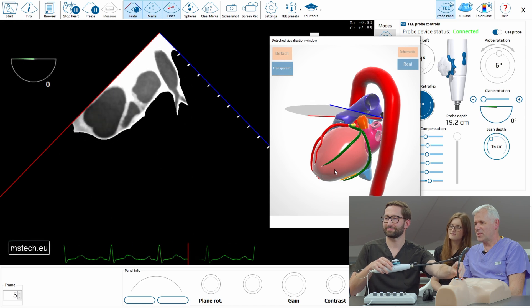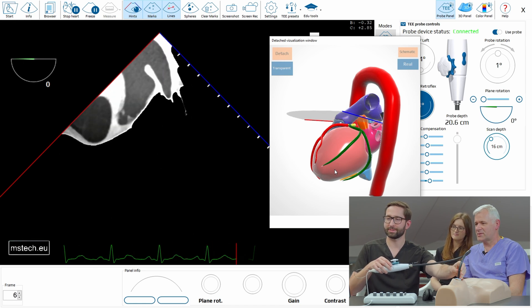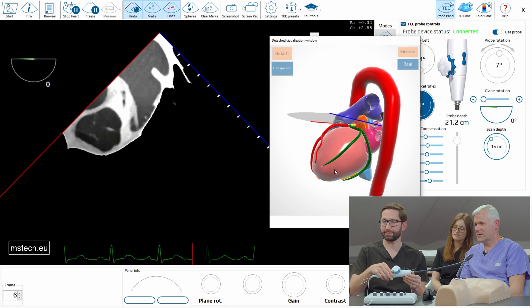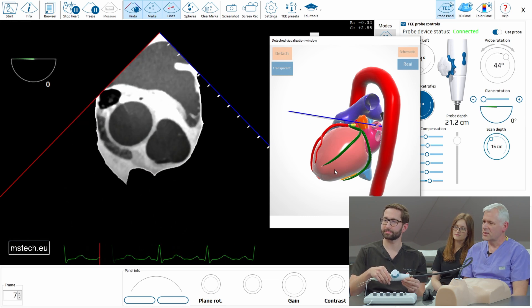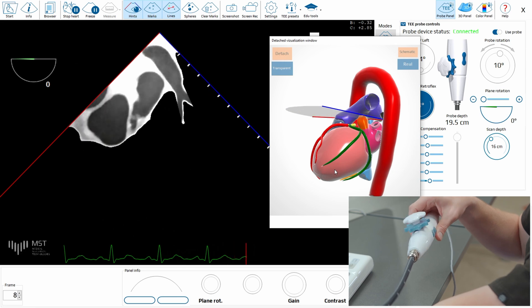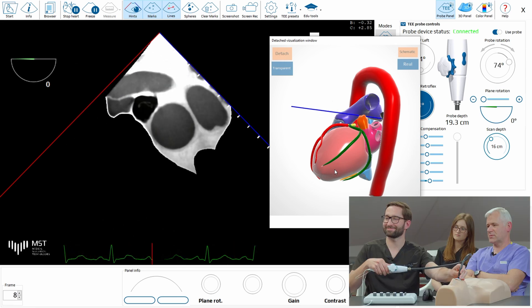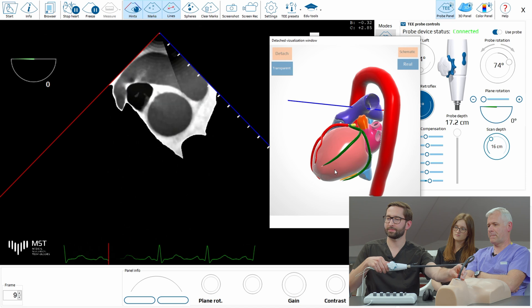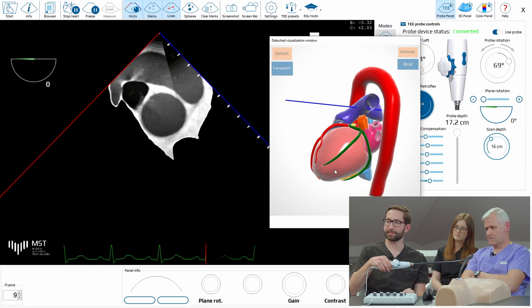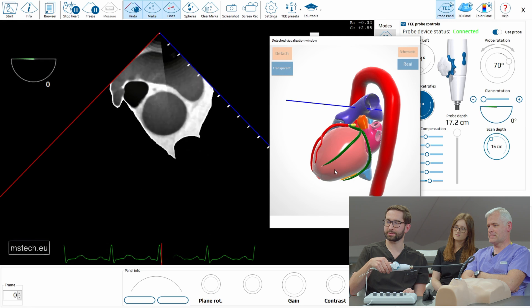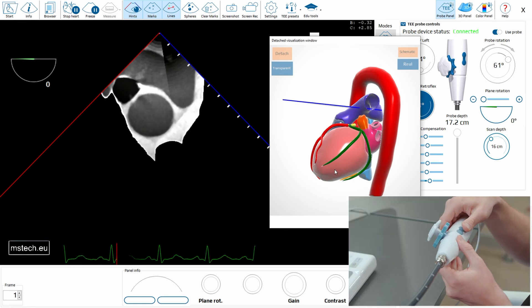So we are now at the top. We start from the upper esophageal view from the big vessels. This is the cross-section of the aorta, and the pulmonary artery just above, and the superior vena cava.